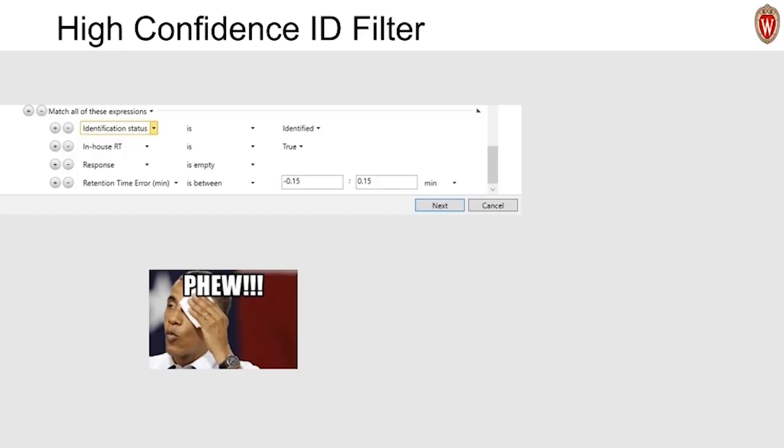There's a lot going on in there, but it really cuts down on the number of matches that we have to weed through to find the ones that are reportable. Once you've made the filter, create a workflow step, select the filters from the Select Filters dropdown, and save the workflow step. If you're using a network system, you may have to do an export-import dance to get these filters and workflows to be available to all users. You can contact either Waters, or I can help you through that if you need to do something like that.